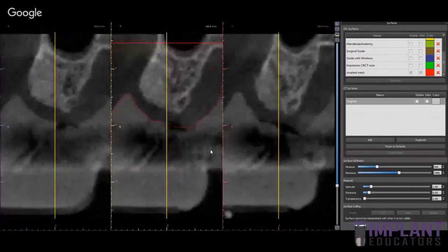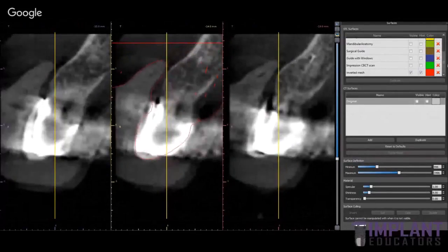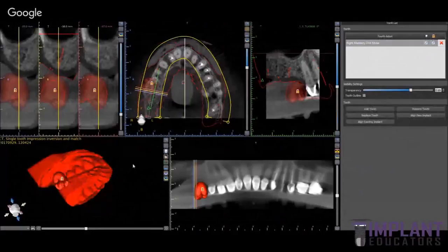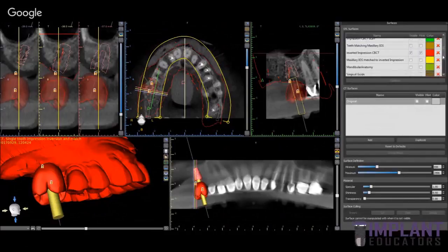So once this is done, now we can use that defined scan. Even though this patient had a lot of zirconia and metal crowns, we can use that defined scan to go ahead and create a prosthetic tooth in place and plan the case for a single tooth implant at the number 3 position. I had already done that on this case, so we'll just click the buttons on and show you the trajectory of the implant going through that prosthetic tooth. And of course, you can bring in the opposing dentition and make sure everything's lined up accurately as well.